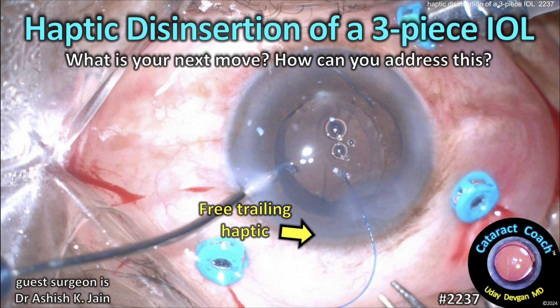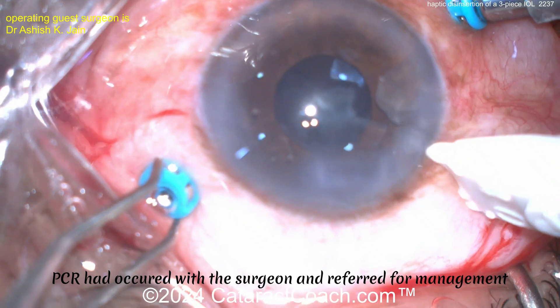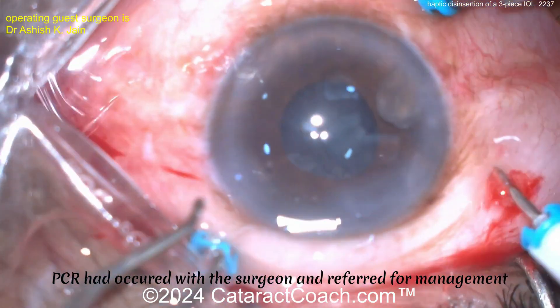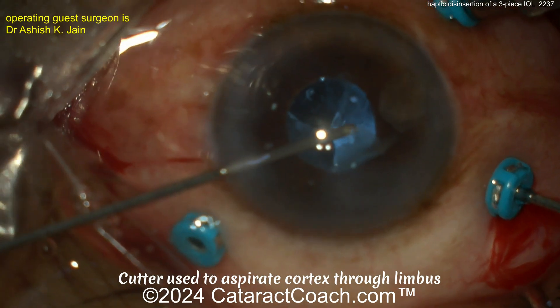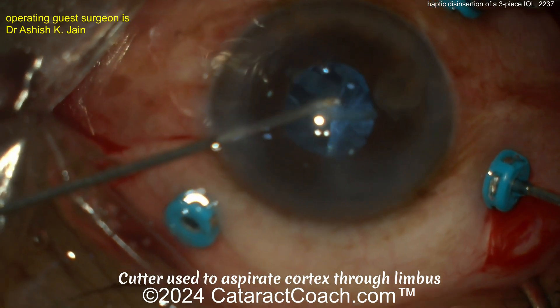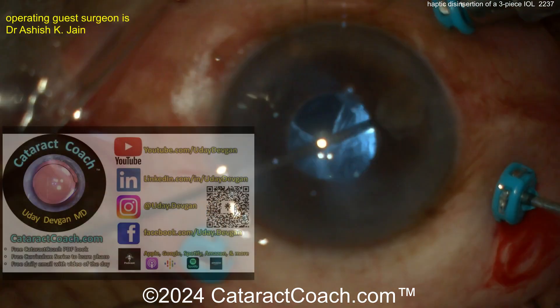Cataractcoach.com — haptic disinsertion of a three-piece IOL. So what's your next move and how do you address this? Let's watch this fun case. Posterior capsule is ruptured; the surgeon was sent this patient for management. You can see there's a nuclear piece in the AC, some cataract material still in the capsule or bag, and probably some piece of cataract in the vitreous.